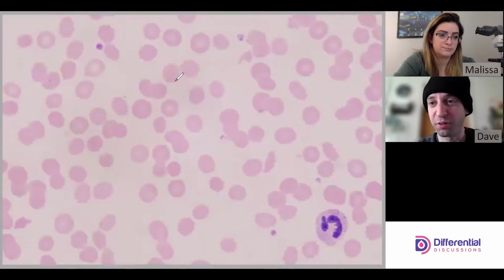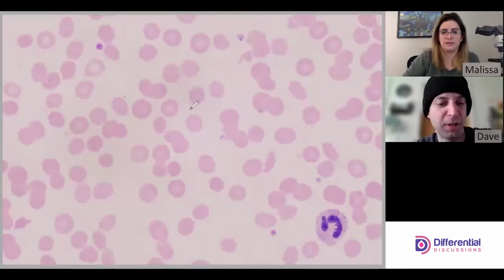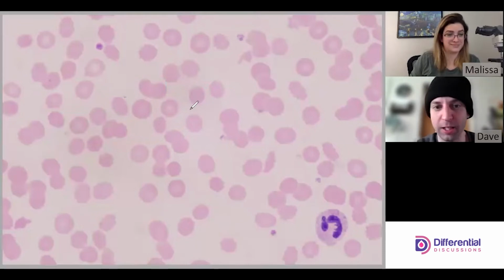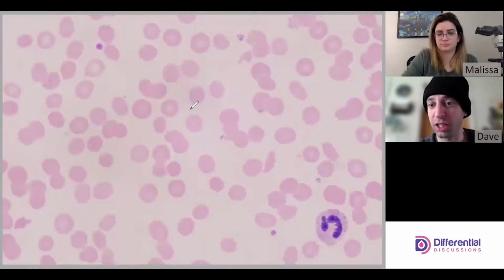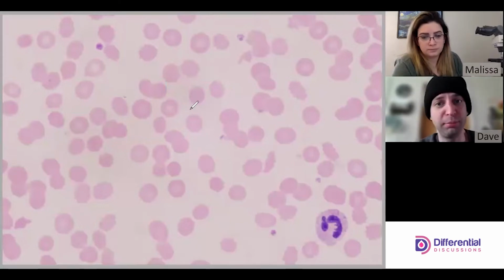Cool. Thank you for that. Of course. All right, so now we're back on the slide. We'll take a look at a few fields, but I'm seeing this field, predictably echinocytes. I do see some ovalo-echinocytes. Yep. And then perhaps the occasional schistocyte too.